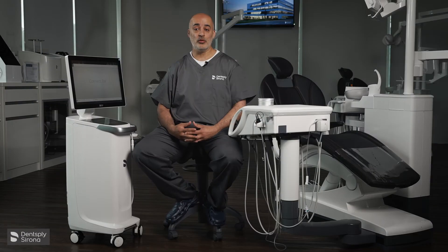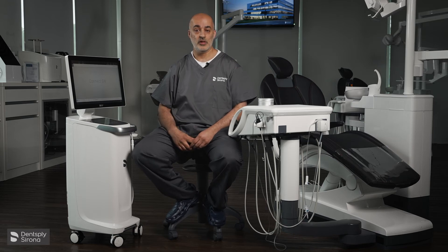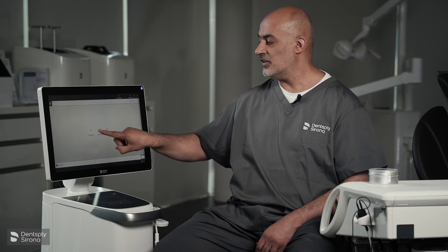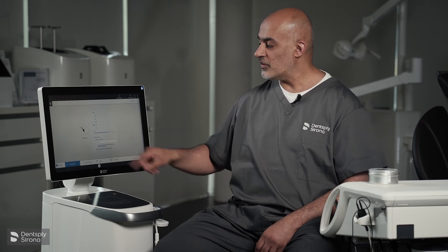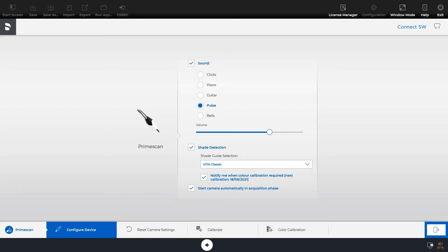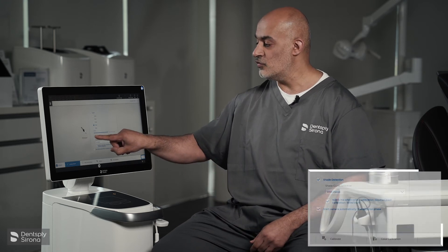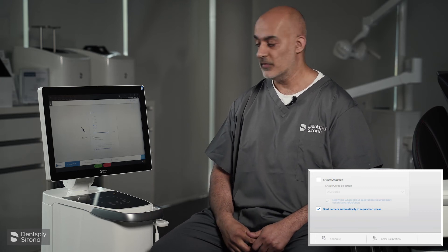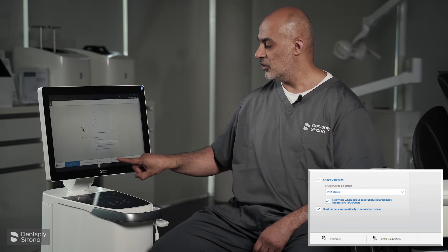Now we're going to talk about colour calibration. This is to maintain trueness and precision. So we move to the Dentsply icon, select configuration, devices, Prime Scan. On this menu, you will notice a shade detection tab. This should be clicked so that we can do the colour calibration. If this is not selected, you will notice that the colour calibration is off. So we select shade detection and then we select colour calibration.